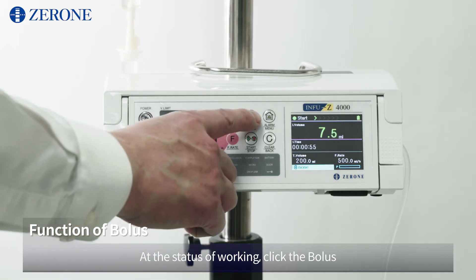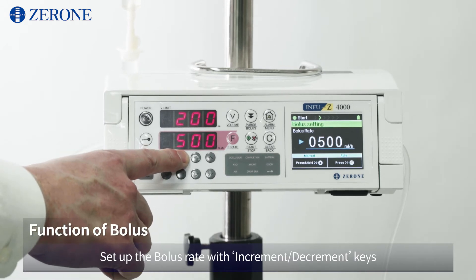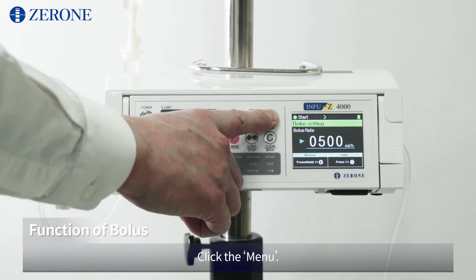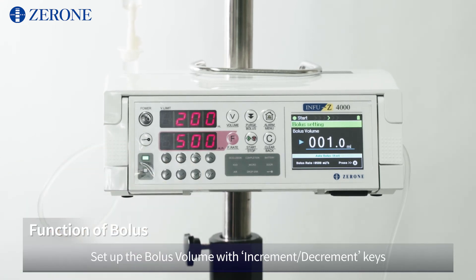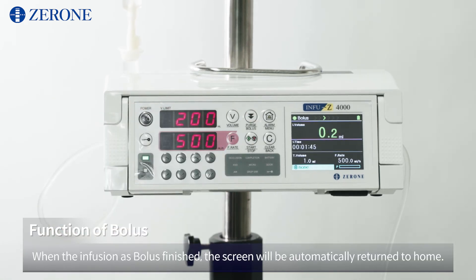At the status of working, click the bolus. Check the screen has changed to set up for bolus rate. Set up the bolus rate with increment/decrement keys. Click the menu and set up the bolus volume with increment/decrement keys. Click the bolus. When the infusion as bolus is finished, the screen will automatically return to home.